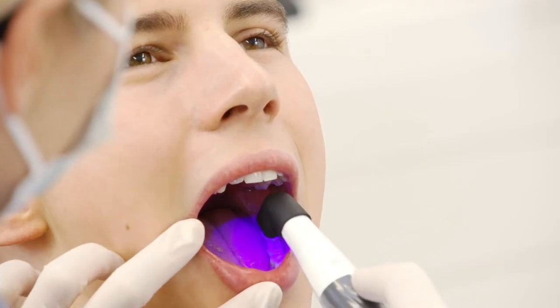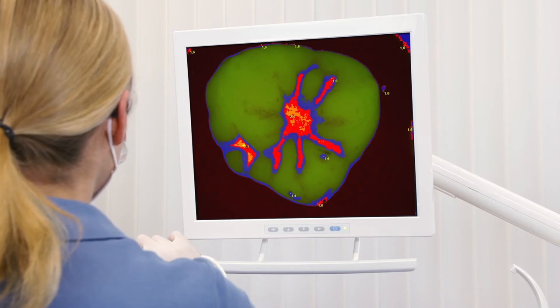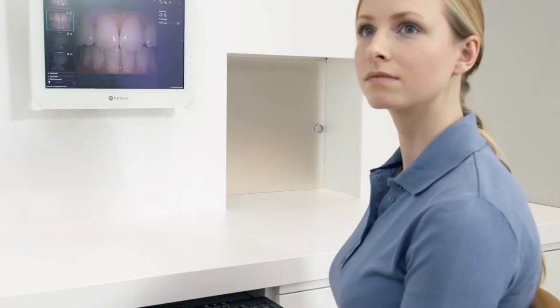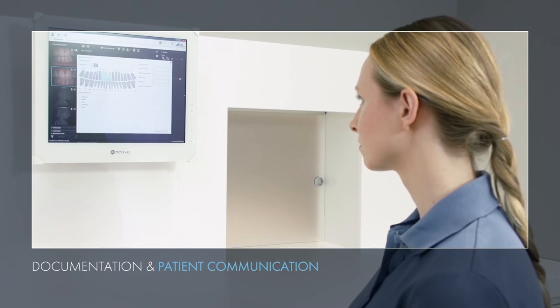It uses methods such as fluorescence technology to create a fast, clear depiction of plaque. And its autofocus technology makes it easy to take oral images that can be used for documentation and are also a useful aid in communicating information to the patient.